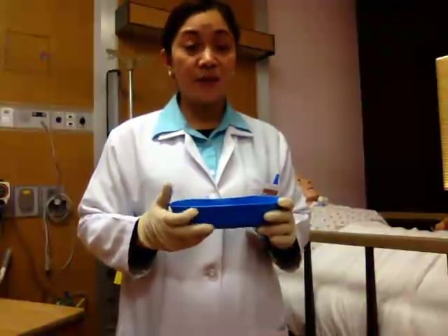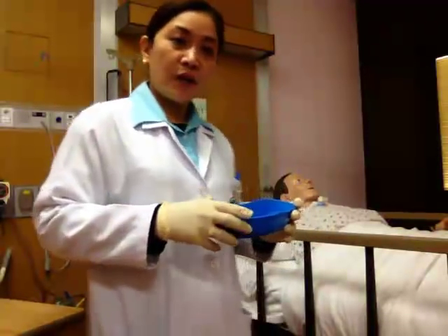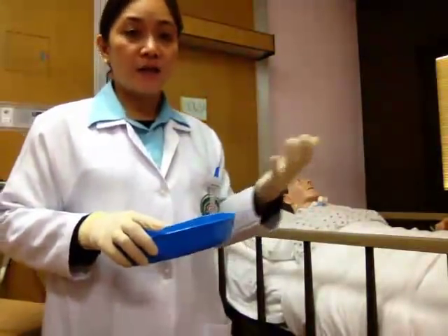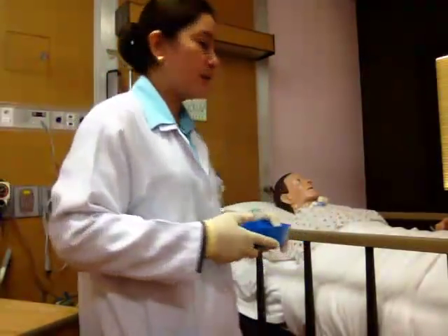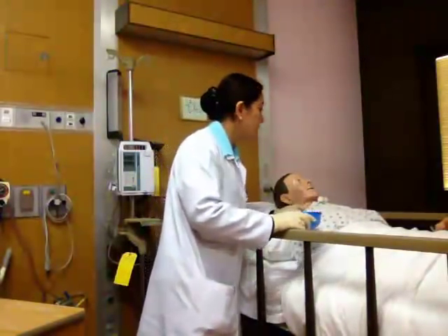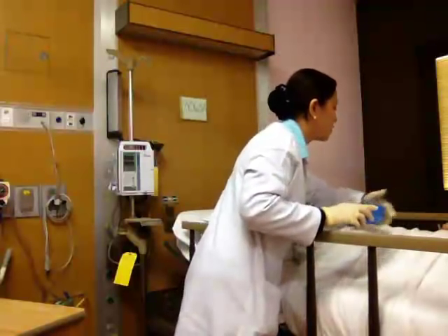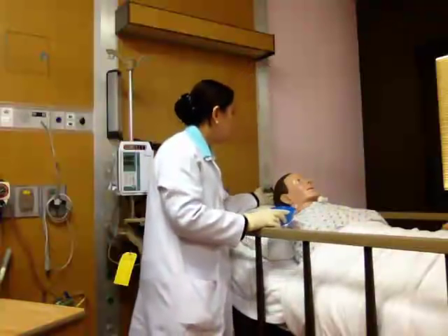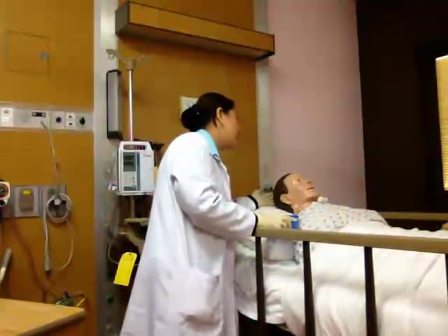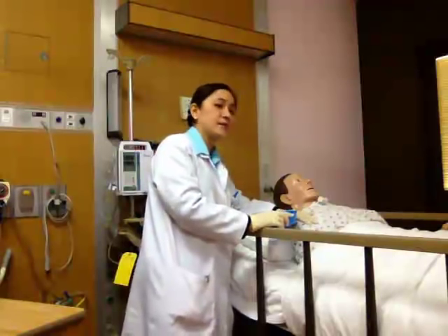Okay, now I'm going to give a subcutaneous injection to our patient. Of course, we have to wear disposable gloves or clean gloves as our protection. We have to identify our patient correctly, explain the procedure, and provide privacy. Sister, what is your name? She said, I'm Aisha. Okay, Aisha, can I check your identity band? Okay, this is Aisha Al-Shamari. So she is the correct patient. Aisha, I'm going to give your medication through subcutaneous injection. And then she said, okay, thank you, sister.